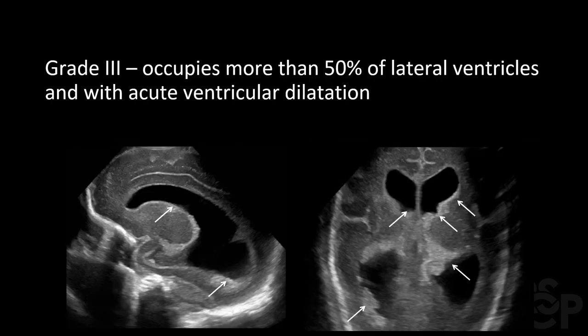Grade 3 will occupy more than 50% of the lateral ventricles with acute ventricular dilatation. This can be seen in the image on the left, where the lateral ventricle is quite enlarged, and in the coronal view on the right. In this case, the hemorrhage is on both sides, making it bilateral and symmetric.